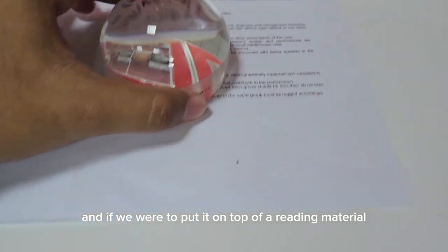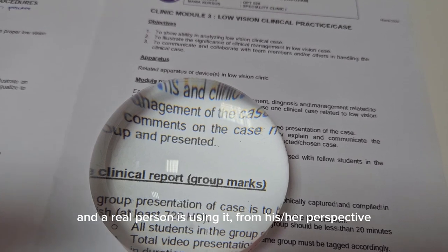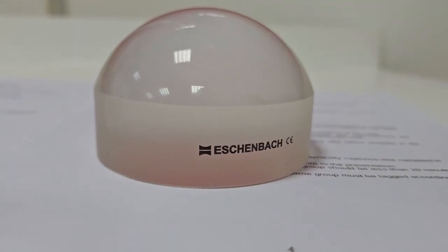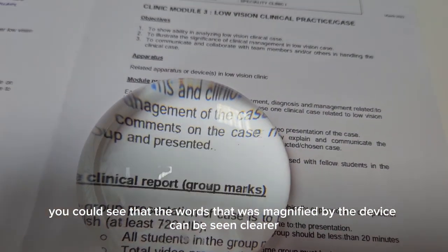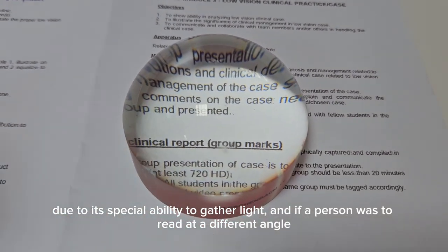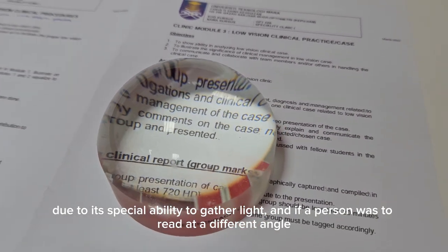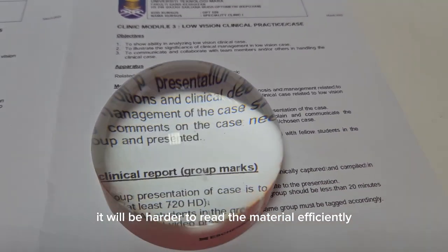If we were to put it on top of a reading material and a real person is using it, from his or her perspective you could see that the words magnified by the device can be seen clearer. This is due to its special ability to gather light. If a person were to read it at a different angle, it would be harder to read the material efficiently.